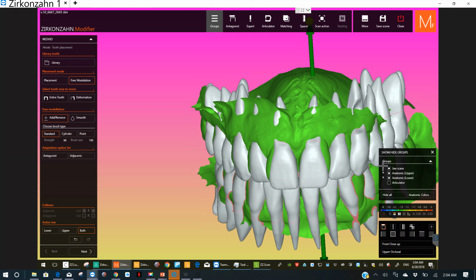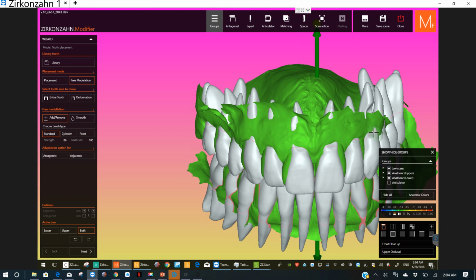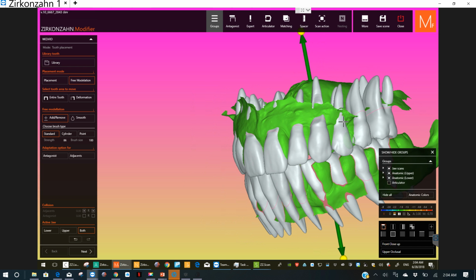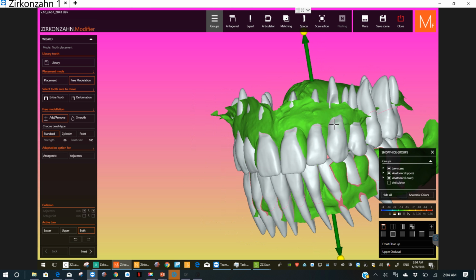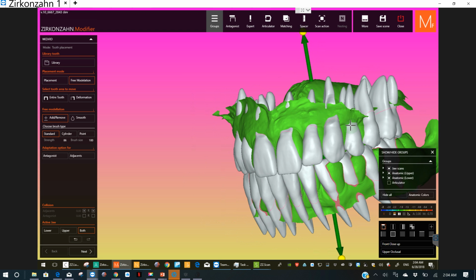So I don't want to necessarily blend that in too much. It should be thicker right there. I want them to start getting used to that and maybe see in the smile what it looks like, because a lot of these people have weird facial deformities from the missing bone and teeth, and if we put a bridge in the right spot, we can support their lip in the right way. So we brought in a very regular shaped set of teeth. If you start changing it a lot, you're probably changing their face too. So this bulkiness right here is probably supporting their lip, and it'll look better. So don't go too crazy.